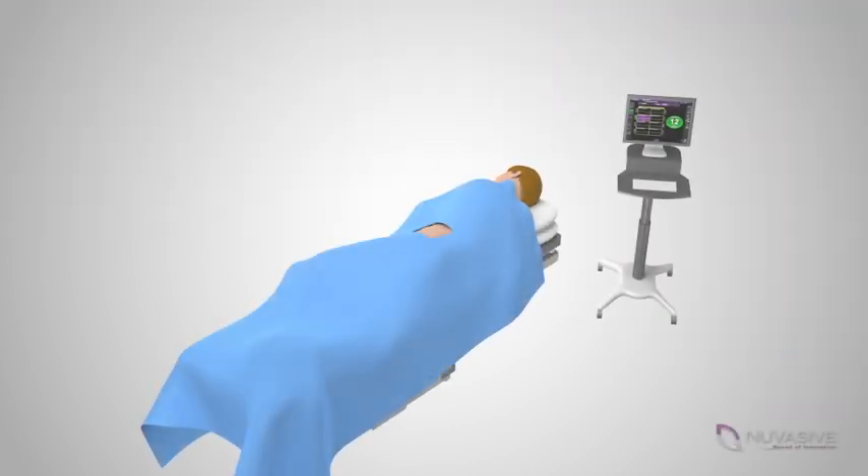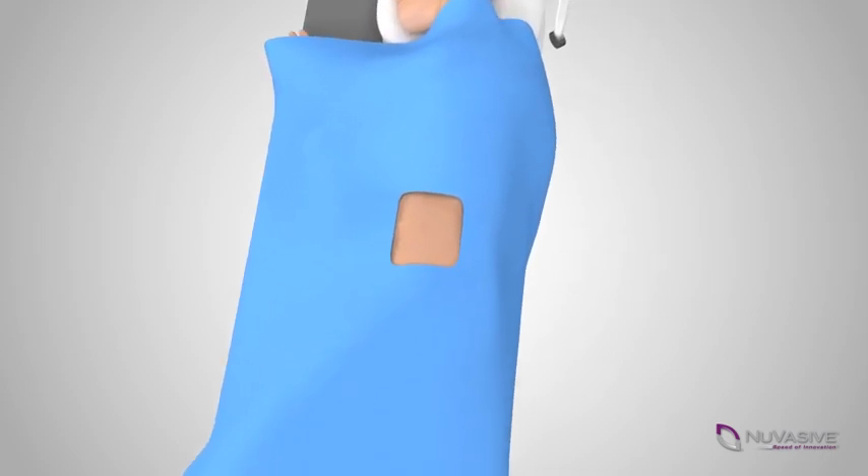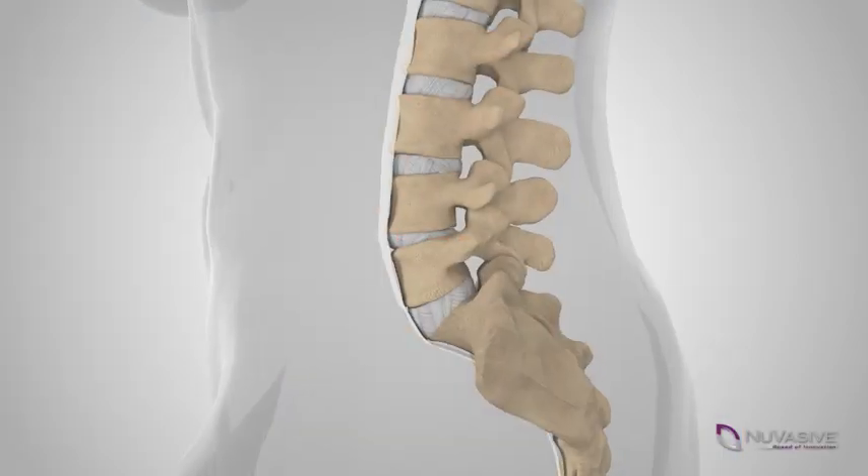When undergoing an XLIF procedure, you will be placed on your side on a surgical table with appropriate surgical padding and draping. Your surgeon will make a small incision on the side of your body.